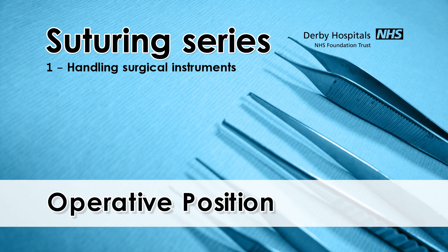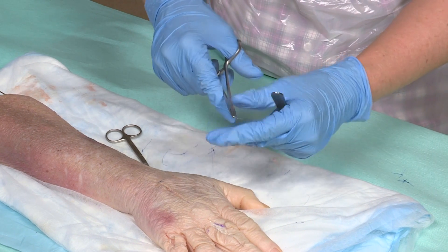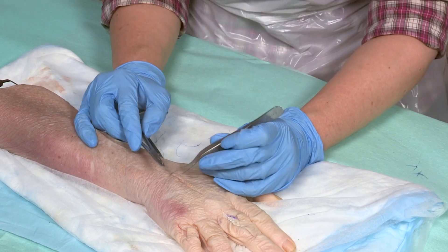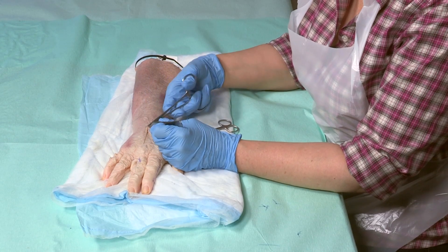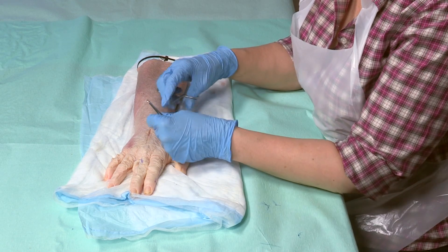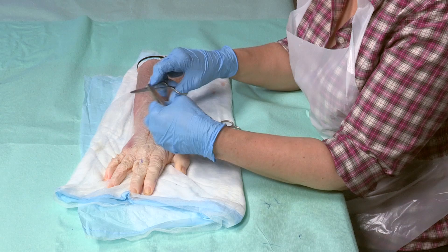It's harder to be accurate and you're more likely to have a tremor if you operate with your hands in mid-air. Always try to operate by resting your hands, and ideally your forearms, so that there is less of a distance between the tip of your instruments and a fixed point. This gives you greater operative control and reduces your tremor.